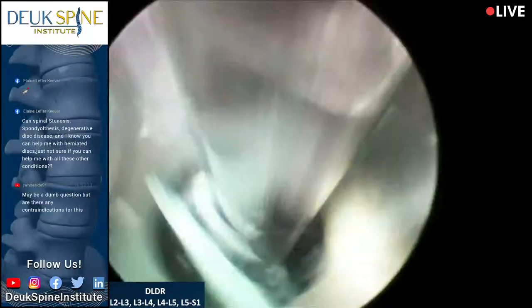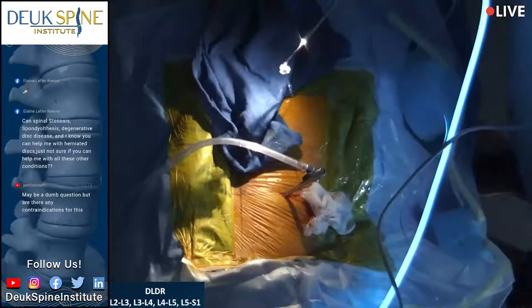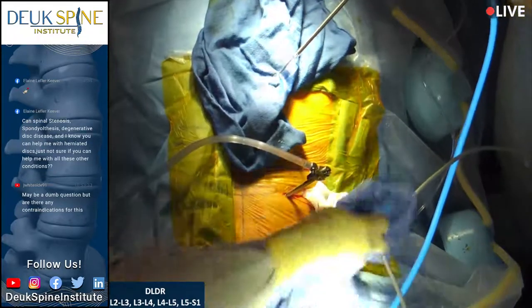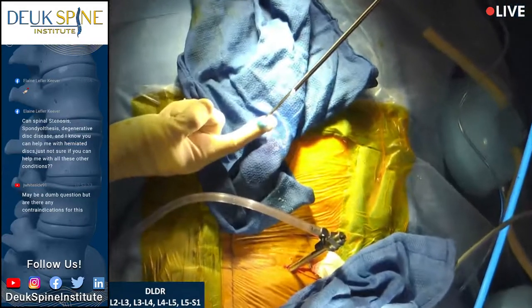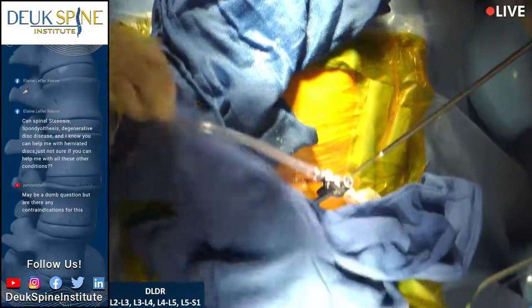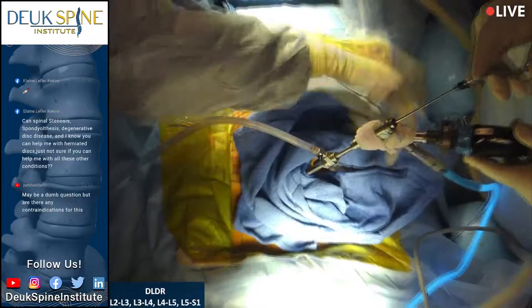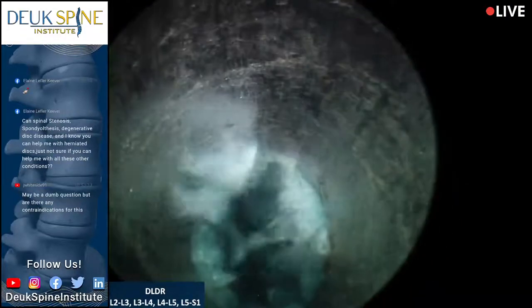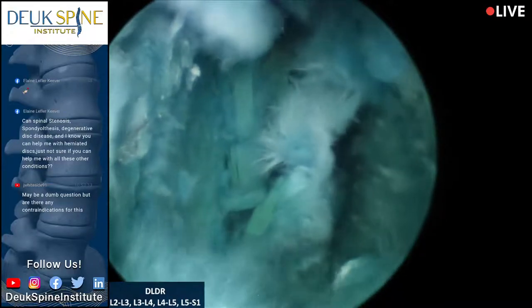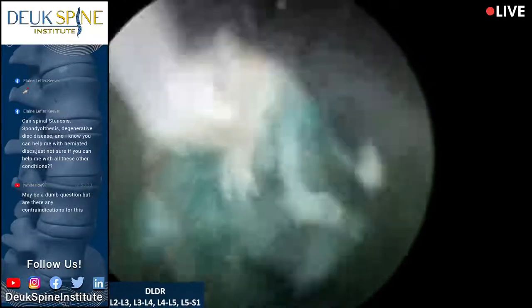Yes. Well, we already fished out a big herniation. Let's show it. Coming to the eye in the sky. Lights on, please. Can you see this? Yes, we can. So that's a pretty good size herniation. Luis, put your finger there so we could compare it. Yeah, look at that thing. So that's from L2-3. So what I can tell you already so far is that L2-3 and L3-4, which are definitely causing a lot of his pain, those are the more recent herniations. And that doesn't surprise me, because most people herniate L5-S1 and L4-5 first, and he's been dealing with that pain for many years. And more recently, I think he's herniated 2-3 and 3-4.